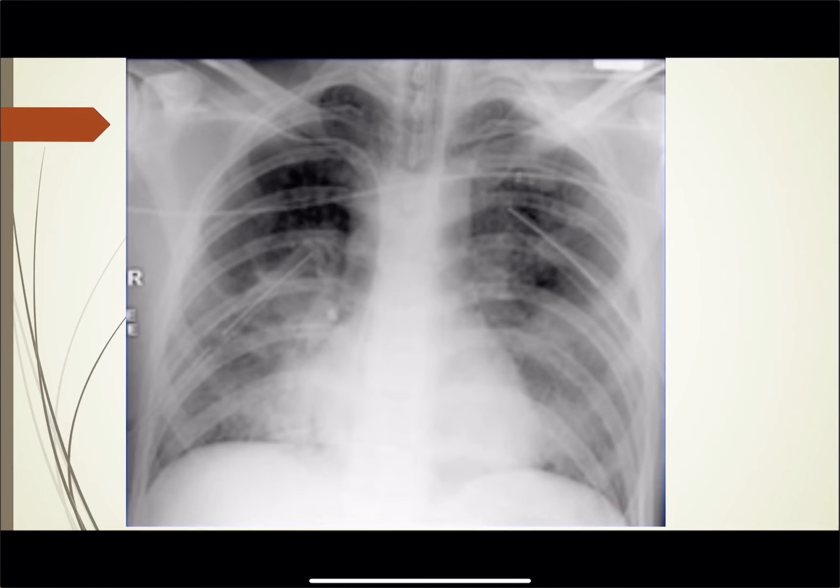Another chest x-ray — this one has a little bit more going on. Starting with the airway: you can see the trachea, but you can't see the carina anywhere. You can see the first rib, although it's kind of cut off. Looks like the second rib is coming right here, that's going to be T2. Counting down: T3, T4, T5, T6 — looks like the ET tube comes down to here, so the endotracheal tube is pretty well positioned.